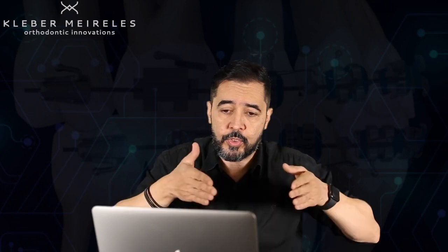Here we're just giving a name to the real torque, to the real torsion. So we can have it positive, we can have it negative, or we can have it neutral. So the torsion can be neutral, no torsion, positive or negative, and the name will depend on the reference that you use.